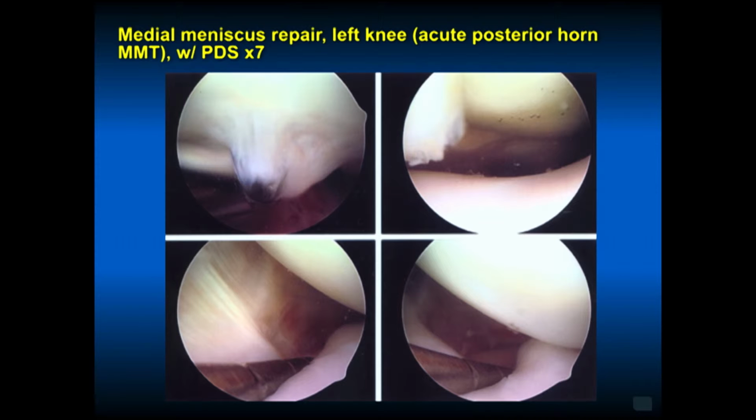This is his arthroscopic finding. The gap here, the meniscus belongs back there, so the red here is the capsule and the rim of the meniscus. So the goal is to get better blood supply by either needling it or doing a trephination with a rasp and then putting that meniscus back to the periphery. There was a little irregularity on his patella, inferior pole of the patella. So groove, patella, and then this is the bed of the meniscus and the displaced meniscus medially.